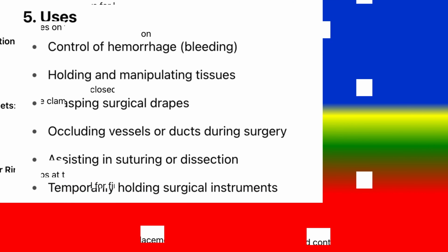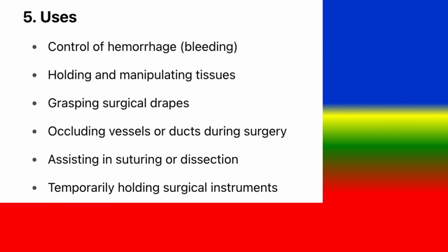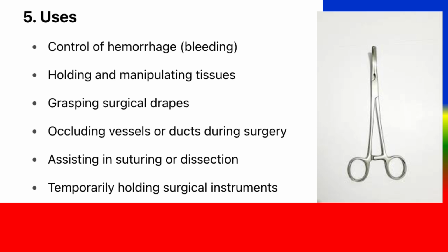5. Uses. Control of hemorrhage, bleeding, holding and manipulating tissues, grasping surgical drapes, occluding vessels or ducts during surgery, assisting in suturing or dissection, temporarily holding surgical instruments.